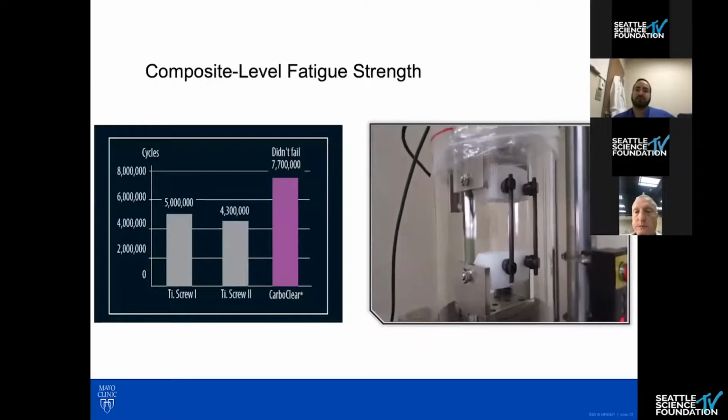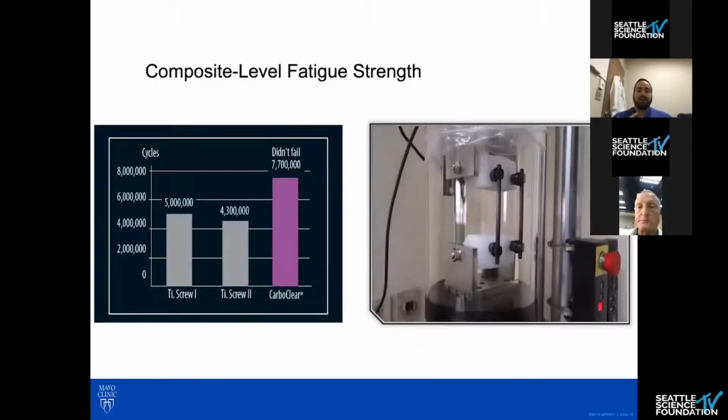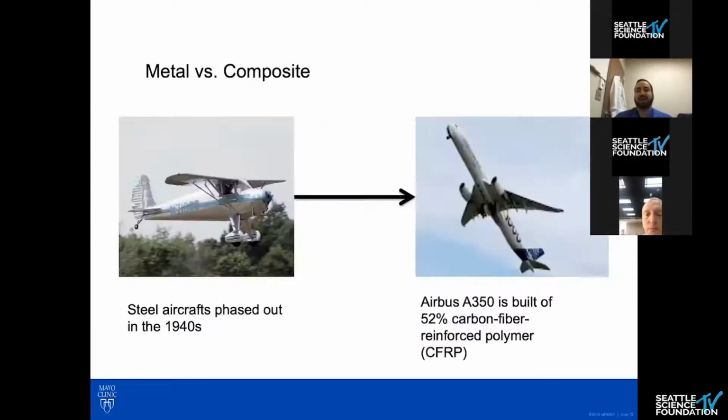And so the thought in a standard healthy individual is that they'll go through arthrodesis before the metal fatigues. In a patient who's not going to undergo standard arthrodesis, you're going to need something that doesn't break. And that's the relevance of using these composite type materials.